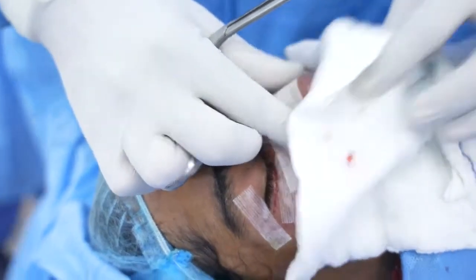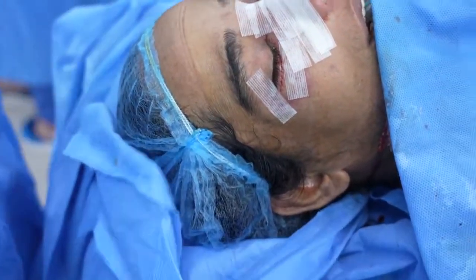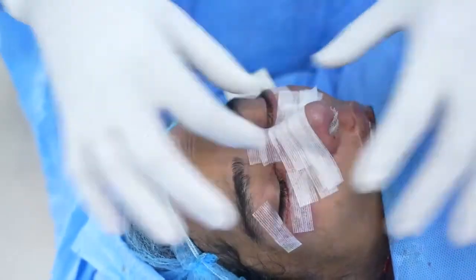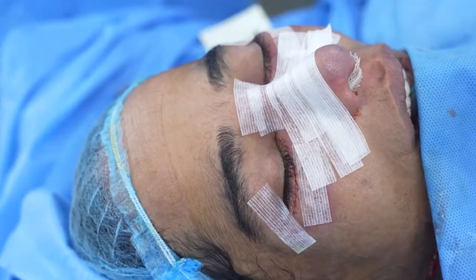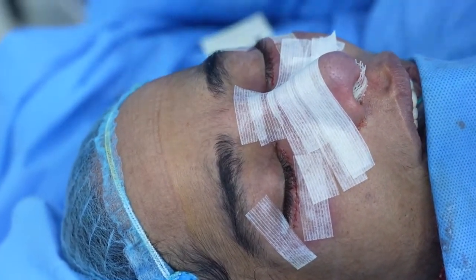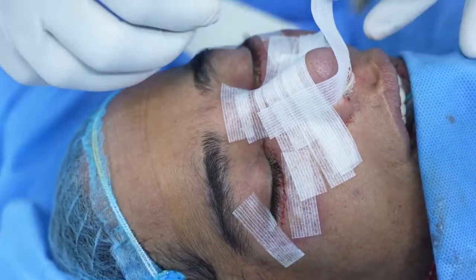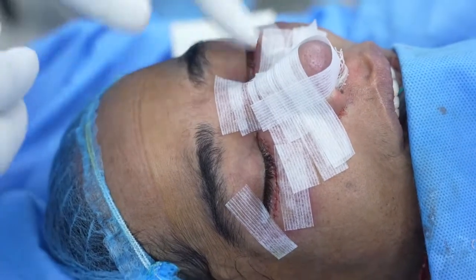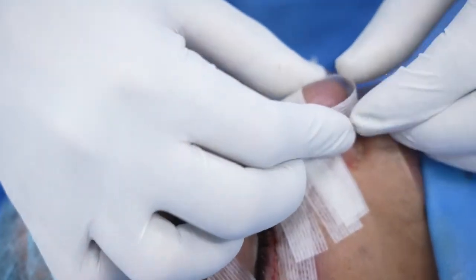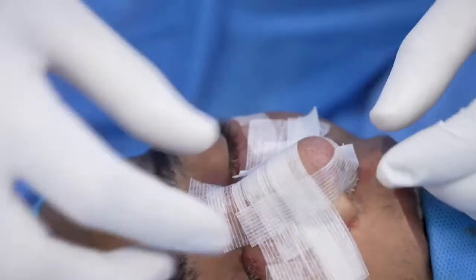Now we're going to put one more steri strip, and this is to keep the nose together. And then we'll put a splint on top, which is a thermosetting splint, meaning we put it in hot water, and then that sets quicker, better, and gets rigid.